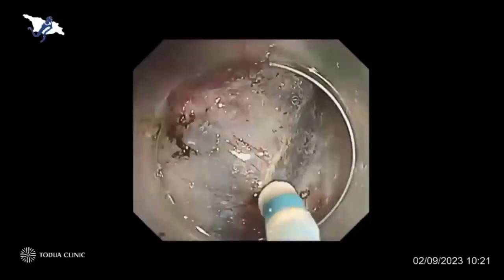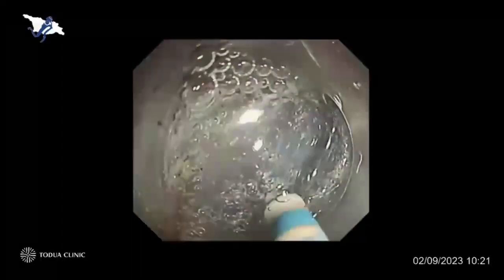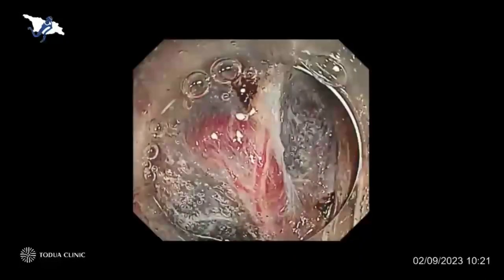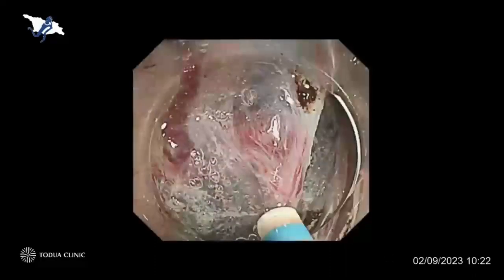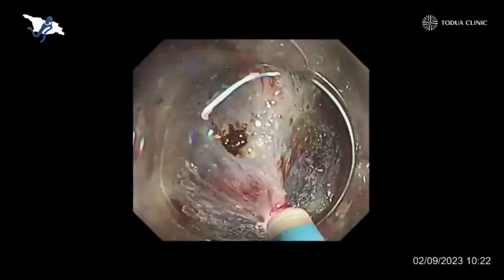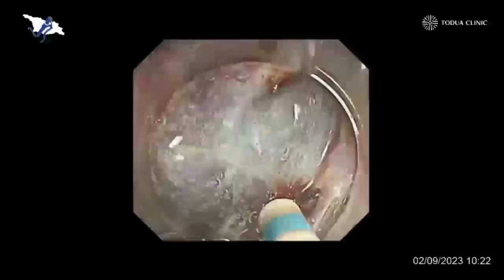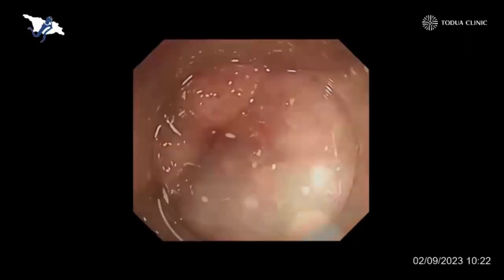It doesn't cause any bleeding if we dissect very slowly. But in case of finding thick blood vessels like this, we should avoid cutting there because it will cause really severe bleeding. Therefore, I usually dissect surrounding tissue without touching the main trunk of very thick blood vessels. Now you can see the very thick blood vessels here. In this particular case, I use the open tip of the dual knife with a very low setting of forced coag. Touching the thick blood vessel from both sides and giving thermal control — we can then easily cut through there without active bleeding. I coagulated the exposed blood vessel using the closed tip of the dual knife.